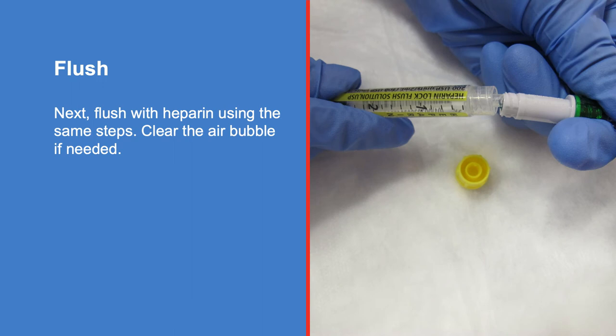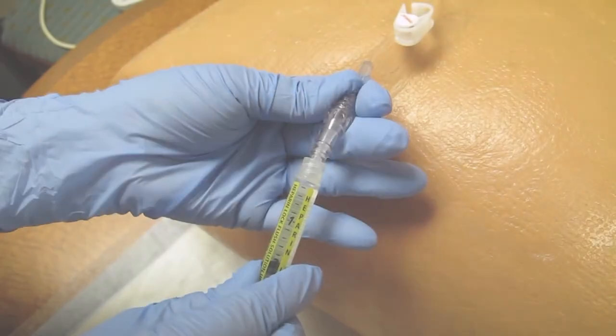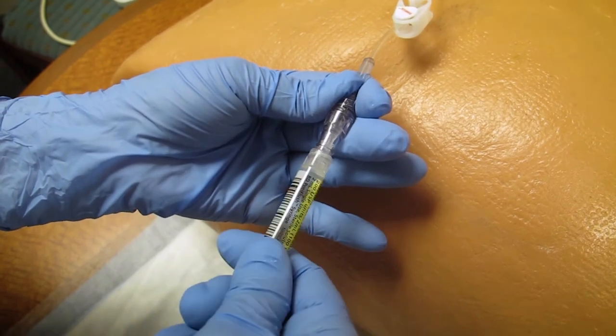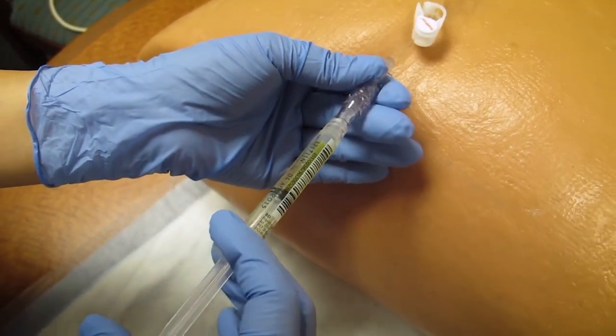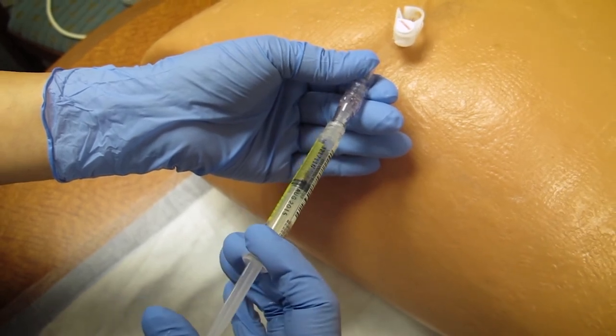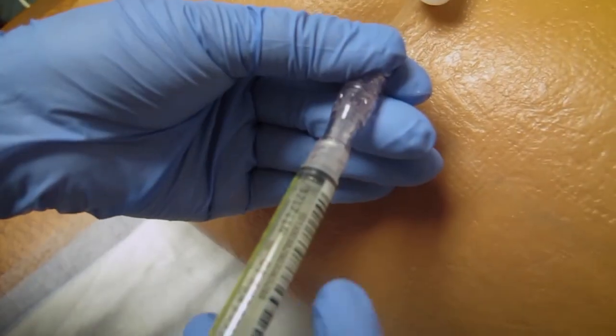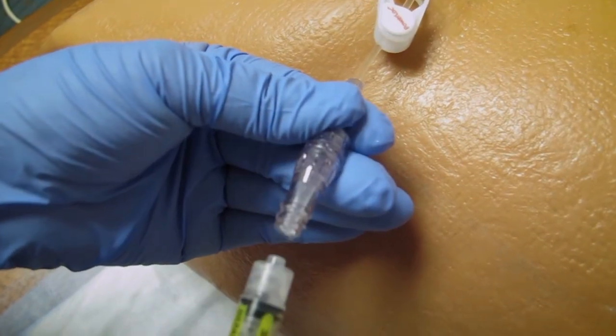Next, flush with heparin using the same steps. Clear the air bubble if needed. Cleanse and air dry as before. Use the same twisting motion to lock the syringe and then push the plunger to deliver the heparin. When you are done, untwist and throw the syringe away.